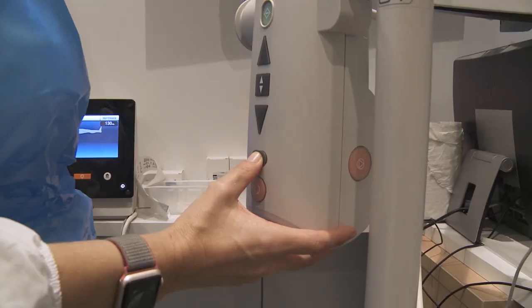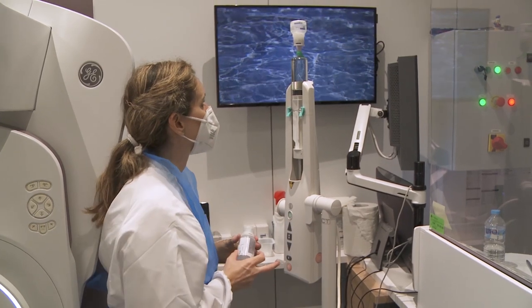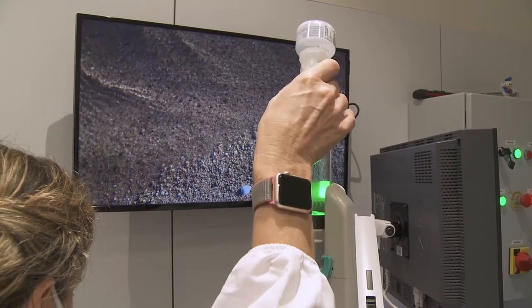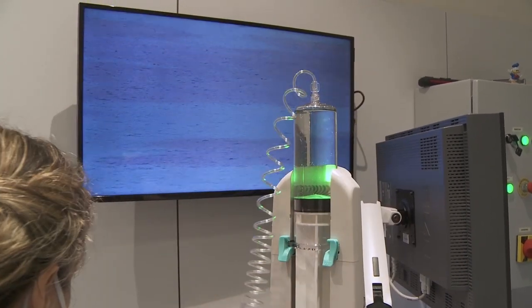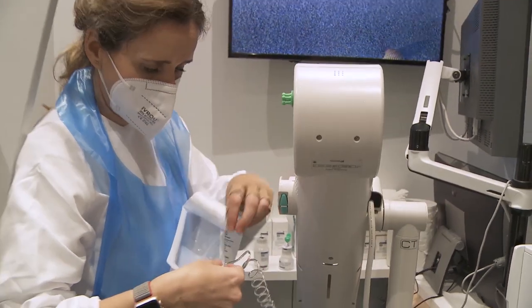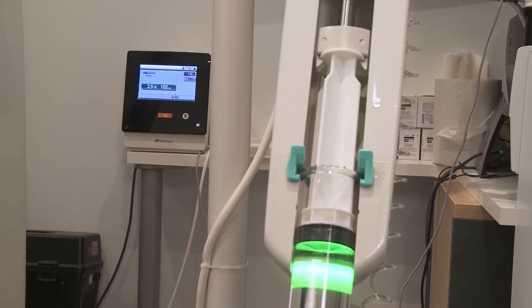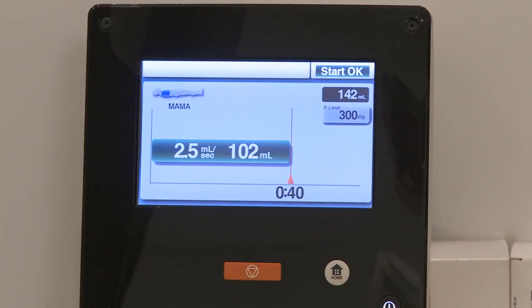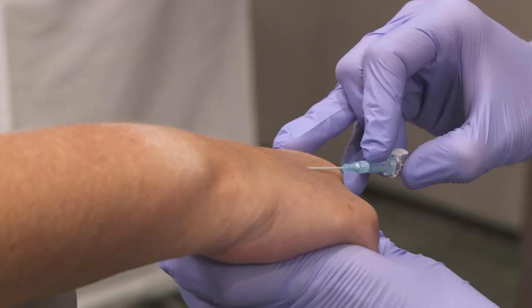The injector syringe is filled with the iodine contrast. Safety checks are completed for air removal. The injector console is set up with volume and flow rate indications. The vessel is prepared for contrast media injection.